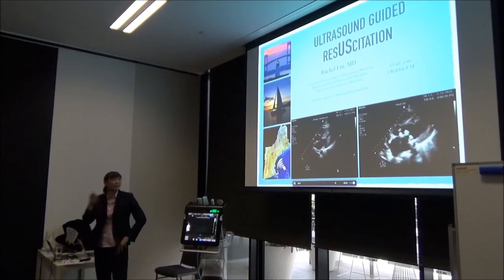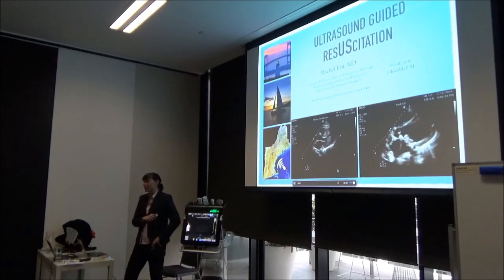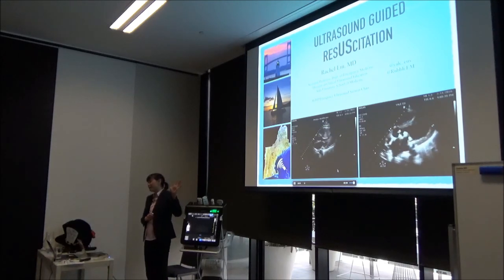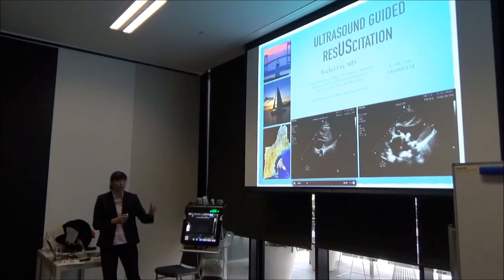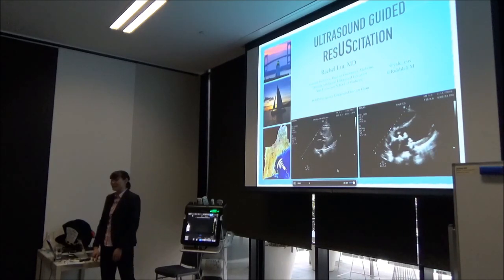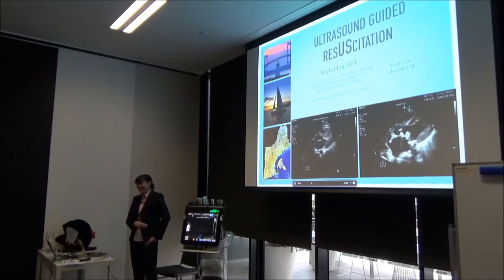Yeah, so this is HOCM, and I love showing these ones. This was actually taken by one of my second-year medical students. And I love it because it shows them the actual physiology of why HOCM is devastating and why this needs to be picked up pretty easily. But that scares me because now do I have to screen every 90-year-old who faints and comes to the ED? I don't know. Just me.